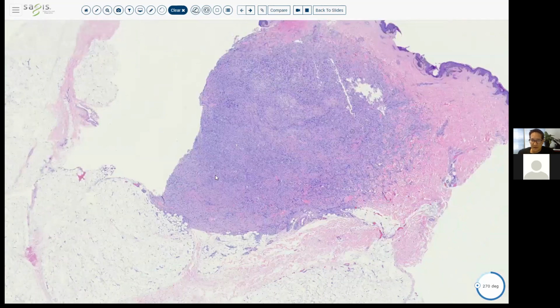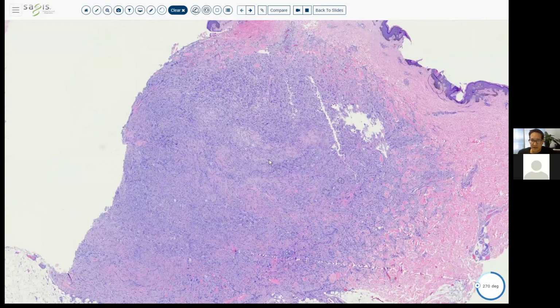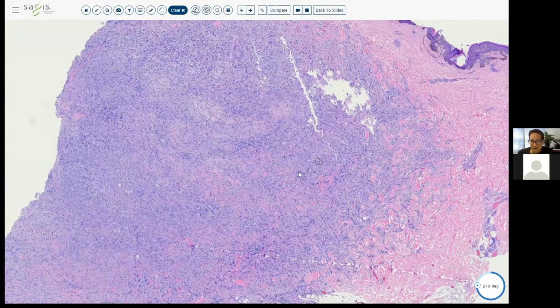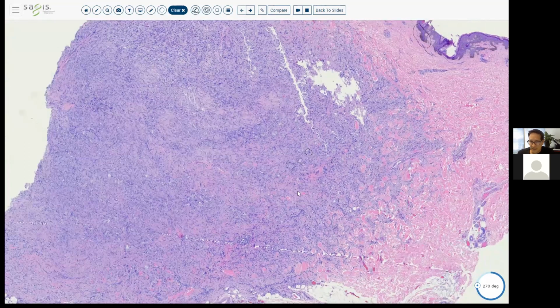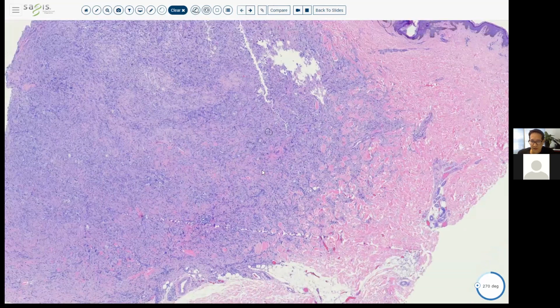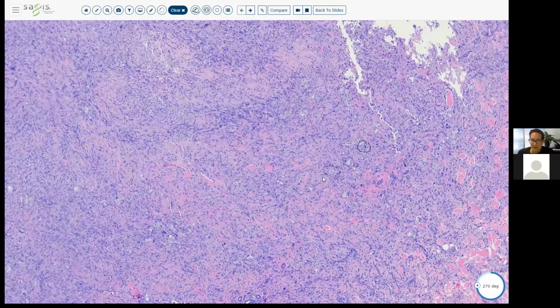And it's quite cellular, so someone might characterize this as a cellular dermatofibroma. And in dermatofibromas, you can start to get foamy cells. You can get some with hemosiderin in the histiocytes. These are basically fibrous histiocytes. They are at the edges creating this, and even within the lesion, creating these thickened collagen bundles. Okay, they are fibrous in nature as well.